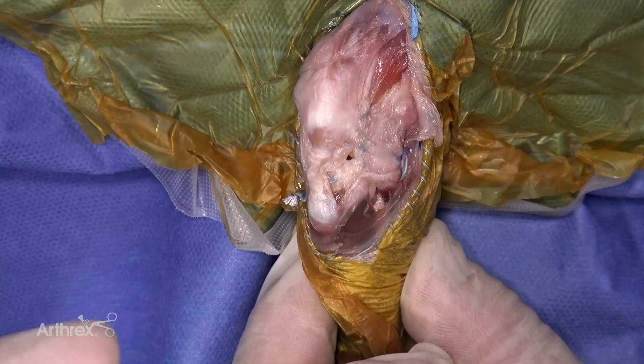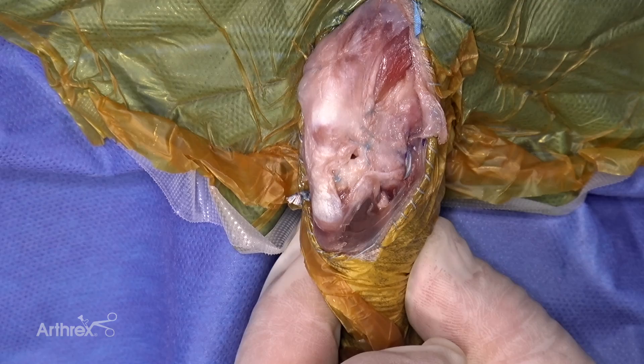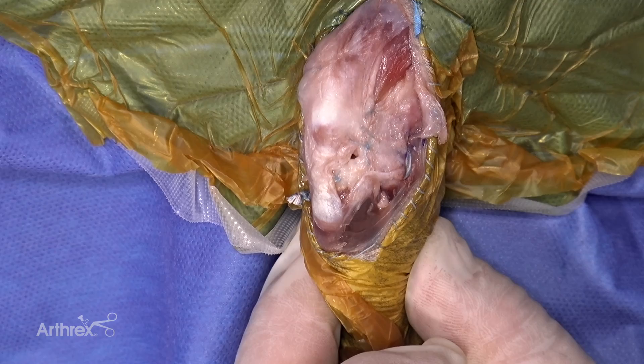You can do the knotless technique or the knotted technique — testing showed no significant difference in pull-out strength between the two. From here you would close the fascia lata and then subcutaneous tissue and skin.